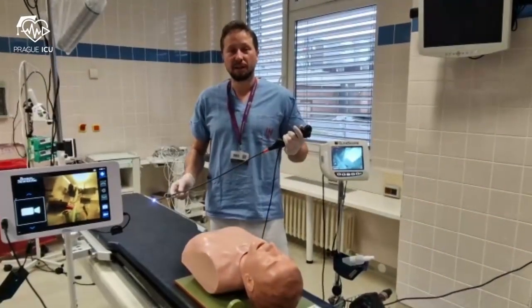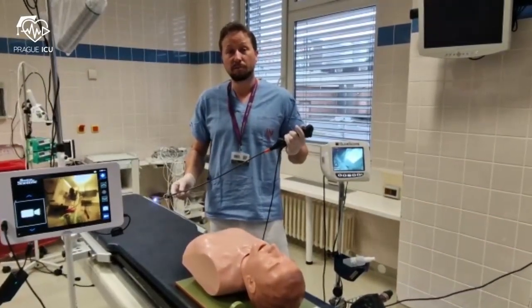Hi guys, I'm Mikhail from Prague ICU and today I will show you how to perform fiber optic intubation.